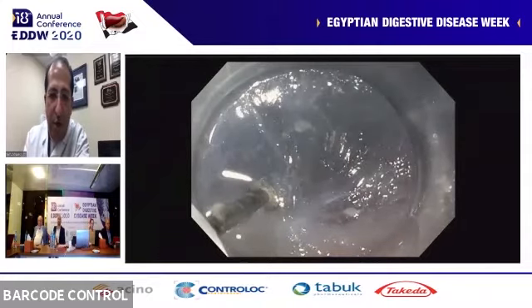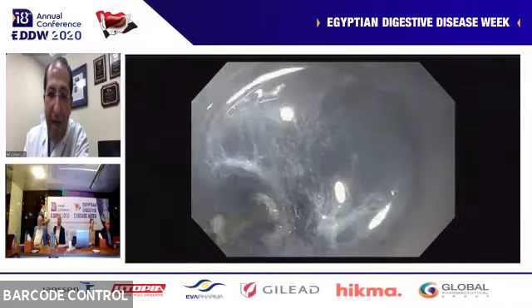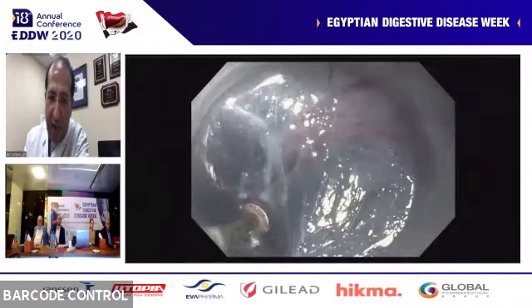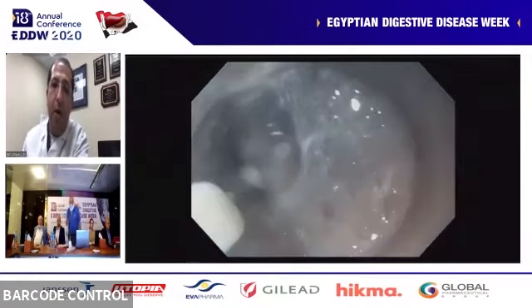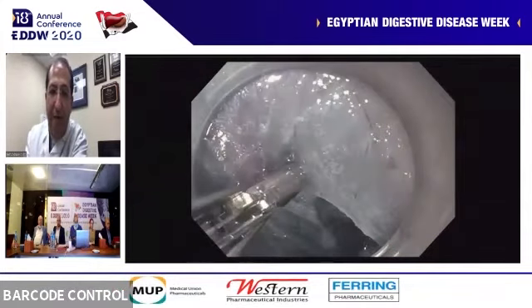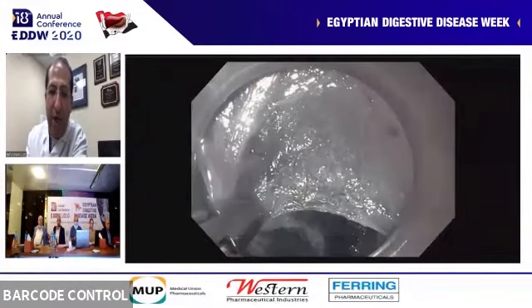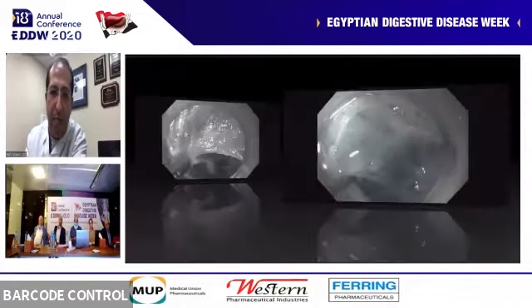I wanted to show you this again. I'm working close and close to the muscle. I'm coagulating vessels with my knife, which is okay if you're experienced to do that, but I'm coagulating the vessels all the way up to the surface. I'm coagulating the source of the vessel. And then if I'm not satisfied with the coagulation of an artery or a vessel that's in the submucosal space, I still use my coag grasper to do it.